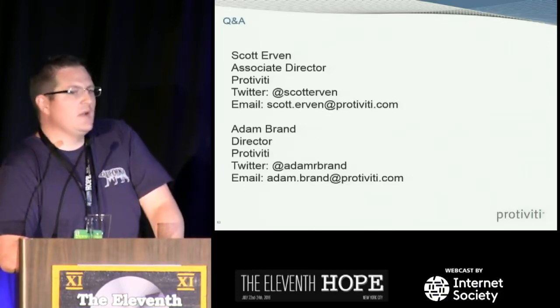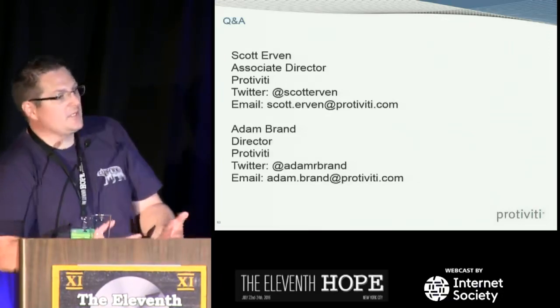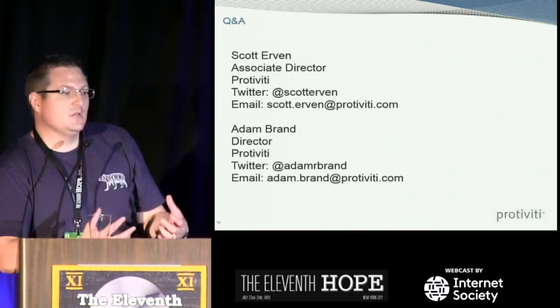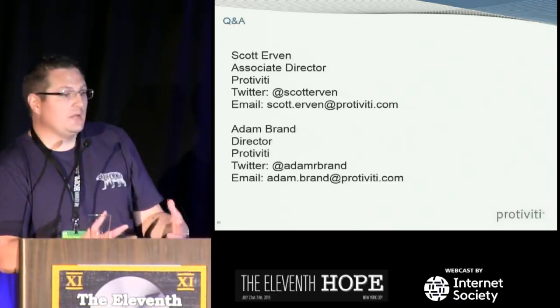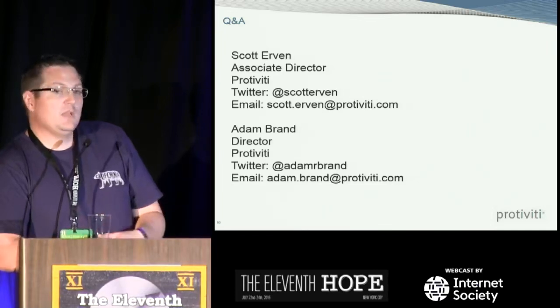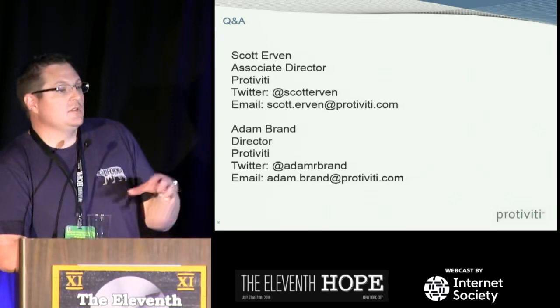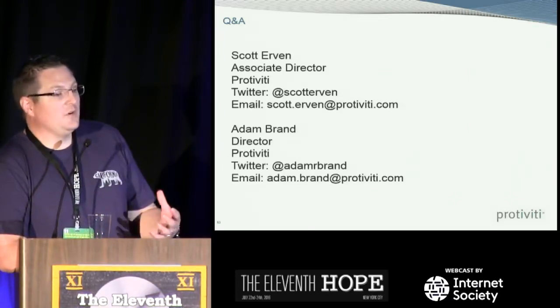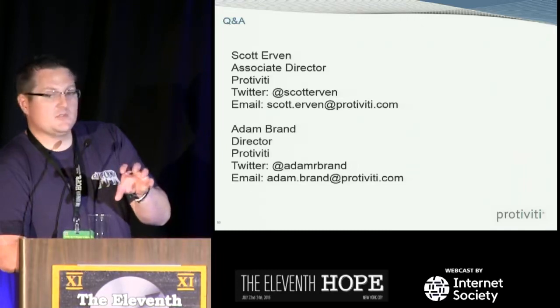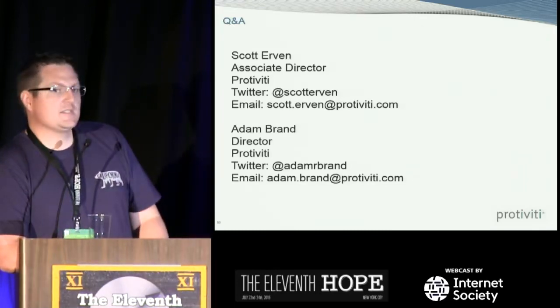So that's there. I think with insulin pumps, it's interesting this idea of artificial pancreas and kind of continual loop. And now you have these systems in development that are going to do a lot clinically for people, right? I mean, bottom line, it's going to help a lot more people than it harms. But the risk is you have the pump talking to the glucose monitor, talking to your smartphone, and it's a full relay, and data integrity becomes an issue if you can compromise that, because the system's automatically treating based on the software.